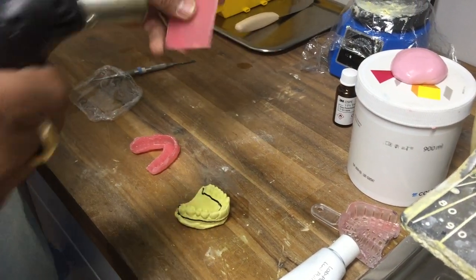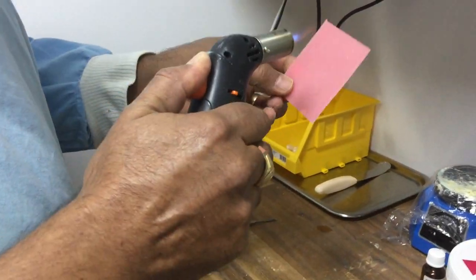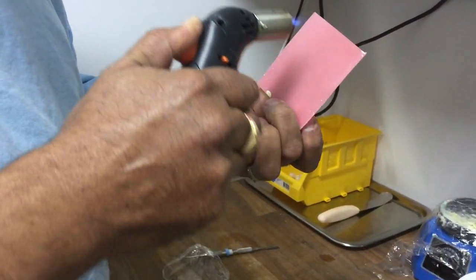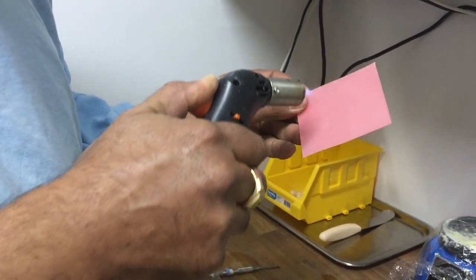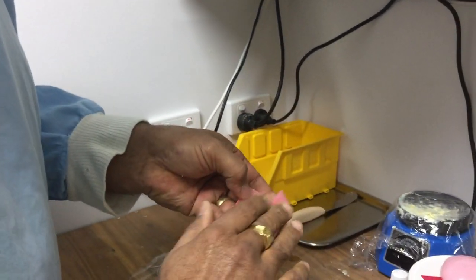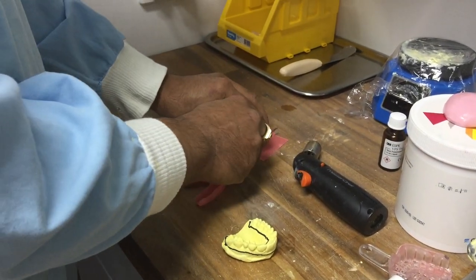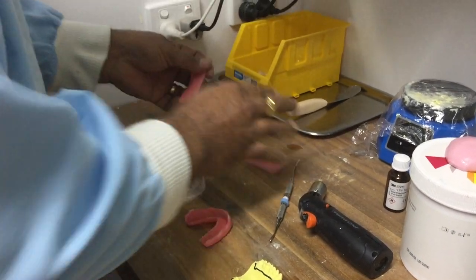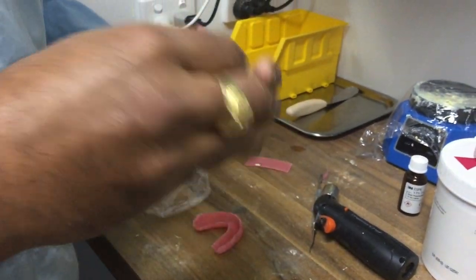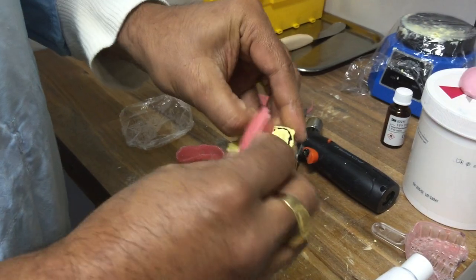Now I get my Bunsen burner and just heat up the wax to soften it a little bit. Make sure one side is heated up a little better than the other, because that's the side that's going to be sticking down. I haven't got a wax knife so I'm just using a Le Cron, and then I apply it like that. That's how I do it.